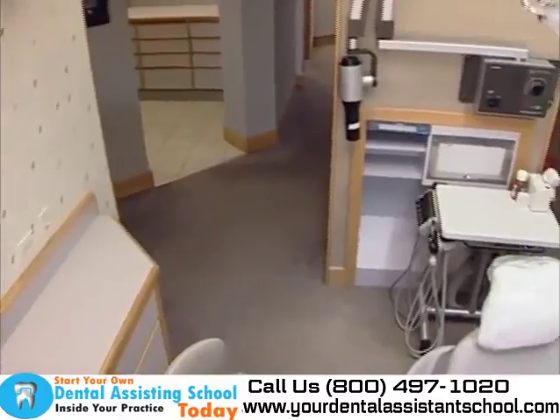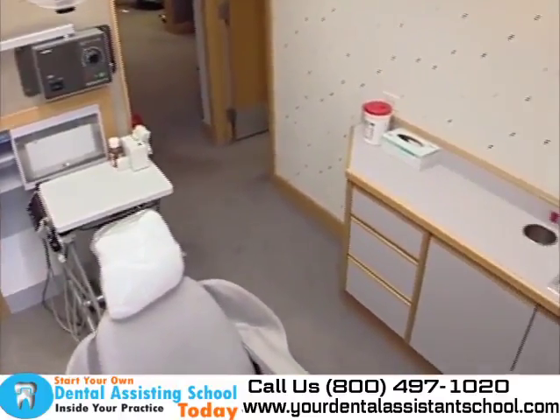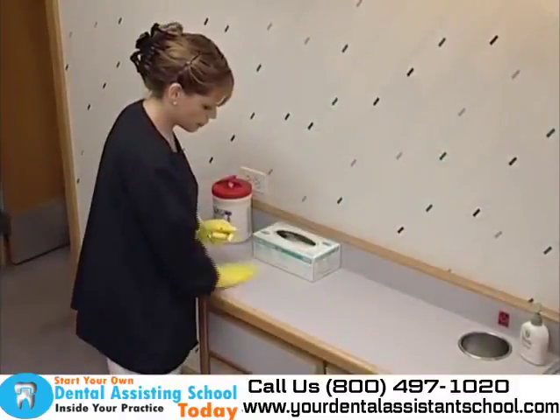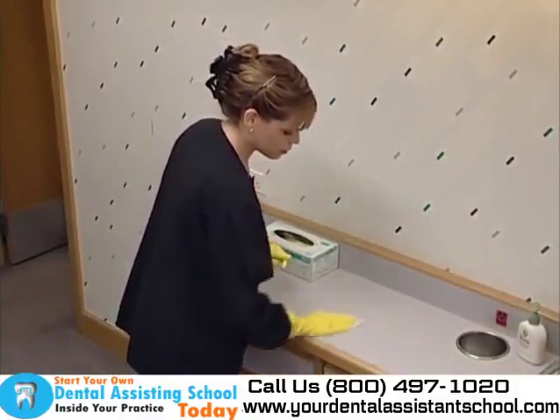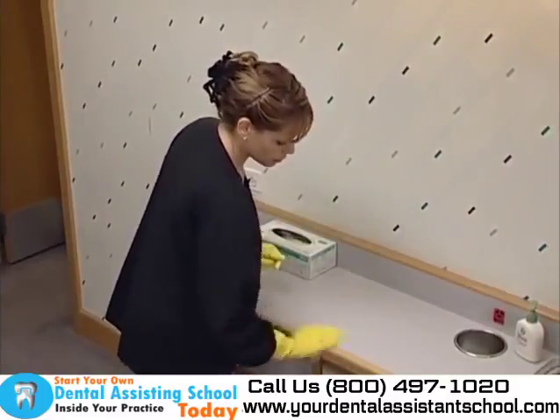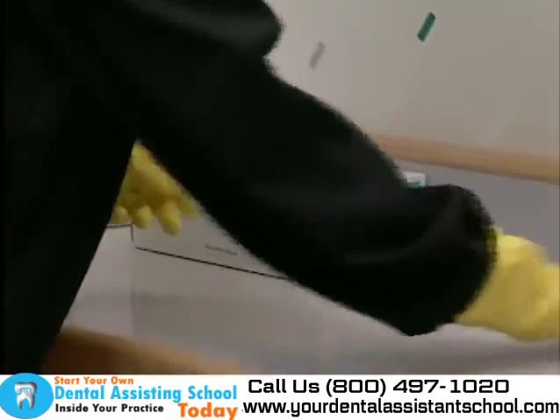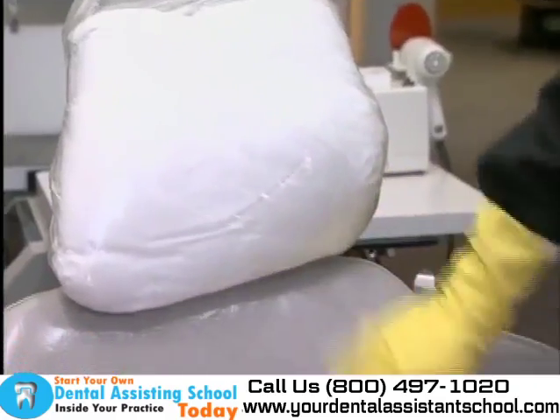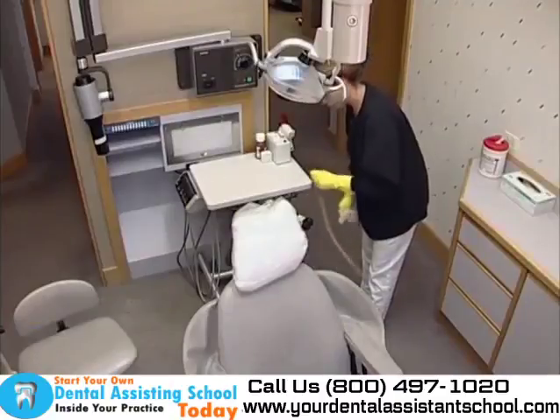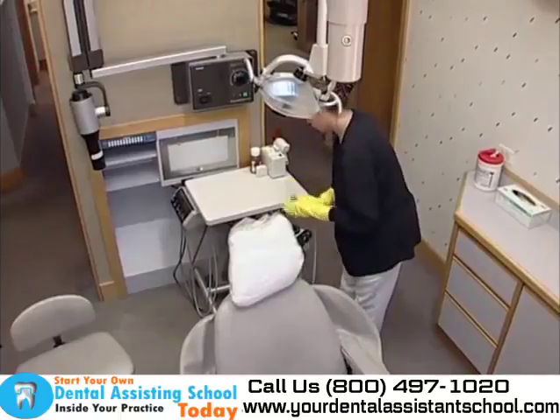Operatories, also called treatment rooms, should be clean from the night before. However, at the start of the day, it is best to thoroughly clean and disinfect the rooms before the first patient arrives. This includes cabinets and handles, light handles, countertops, the X-ray head, tray tables, chair and headrest, the high-speed evacuator, tubing for handpieces, and the air-water syringe.